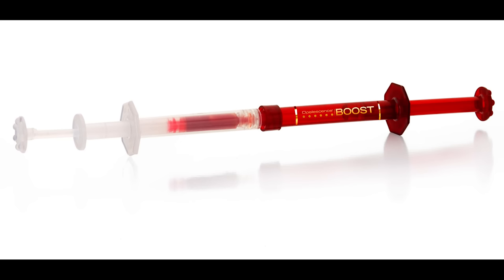Though I'll be using the Opalescence Boost from Ultradent for this demonstration, the basic procedure remains the same with other in-office bleaching materials as well. Opalescence Boost is a 40% hydrogen peroxide and it is a chemically activated bleach, and hence you will see that I'm not using any kind of bleaching light for this process.